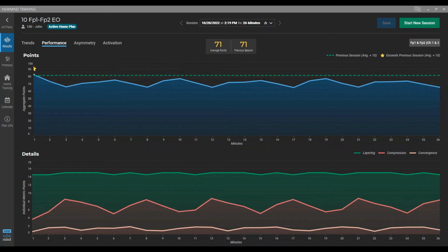But Rodney, when you see that, sometimes I'll pause the session and ask the patient, it looks like your alpha's a bit high in your thinking, what are you thinking about? That gives you a sense of whether it's just a busy mind or something emotional. That's one of the things I do to get clarity with trend screens like that.